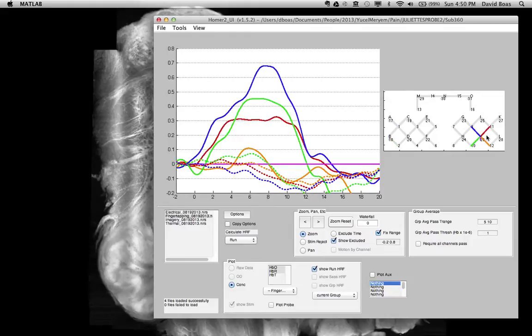So we just showed you three useful features: waterfall, fixed plot range, and selecting multiple channels.